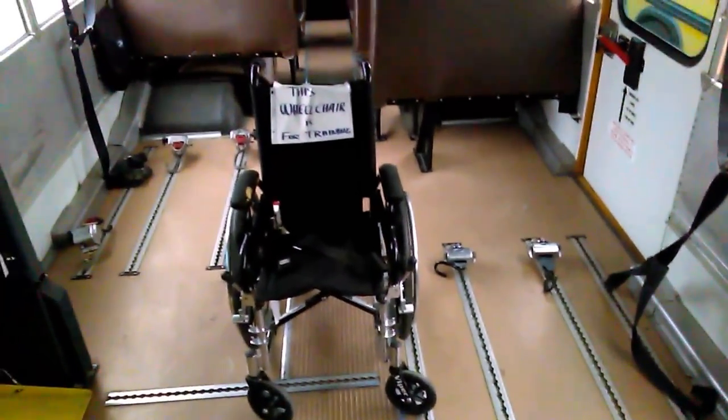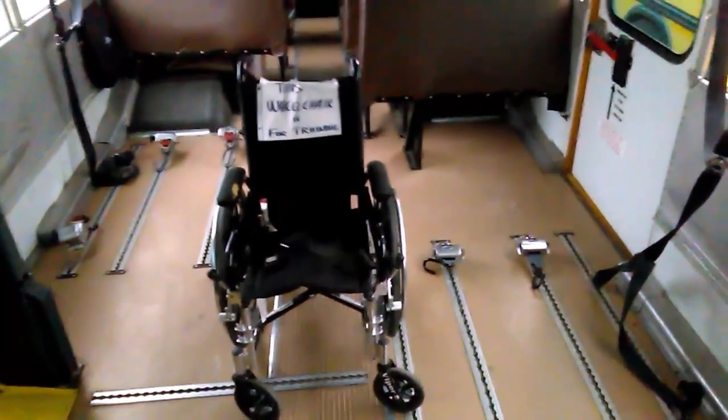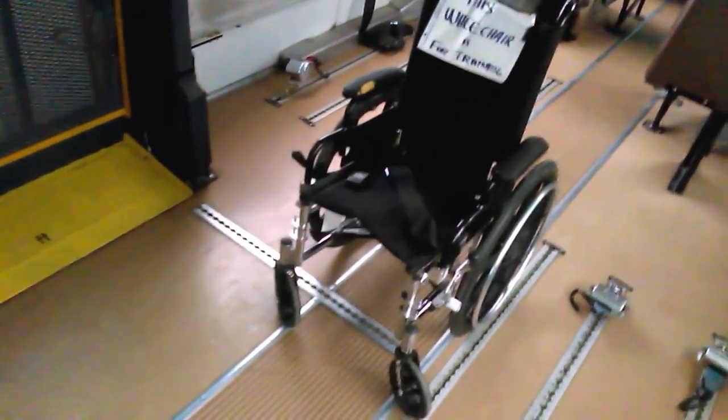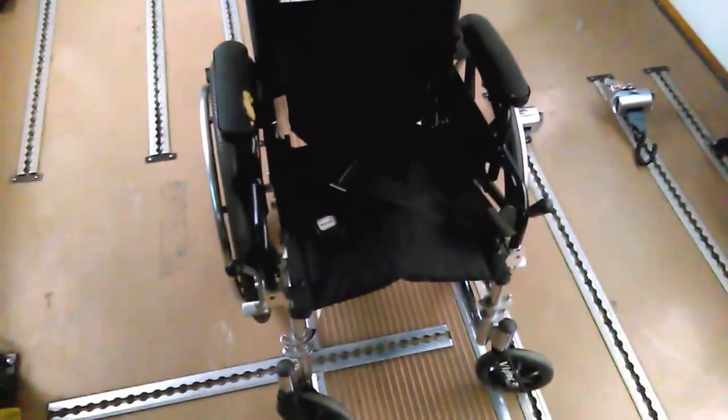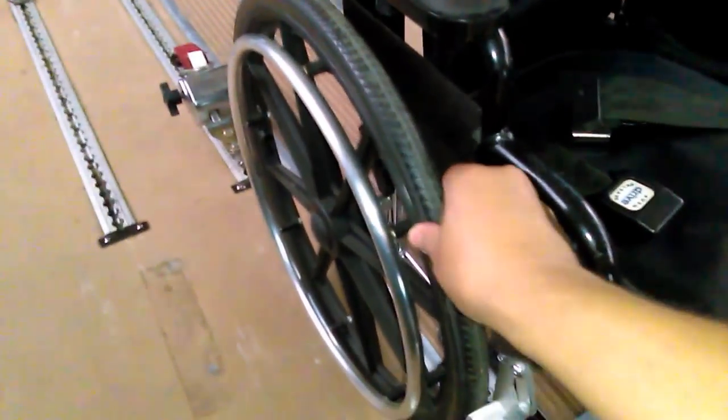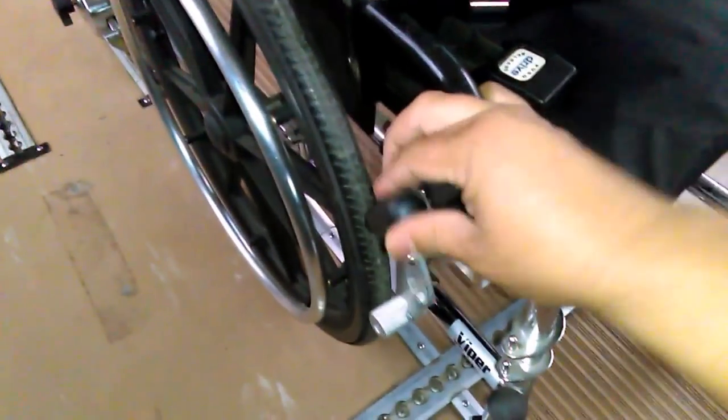This is the wheelchair I'm going to be securing to this bus. This is an average wheelchair for a small kid, probably between the ages of five and ten. The first thing I do whenever I see a wheelchair student is check the wheelchair itself to make sure it's in good condition — that the tires are in good condition, not loose or cracked, and that the braking mechanism actually holds and locks.